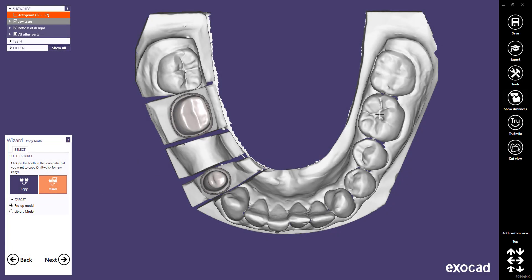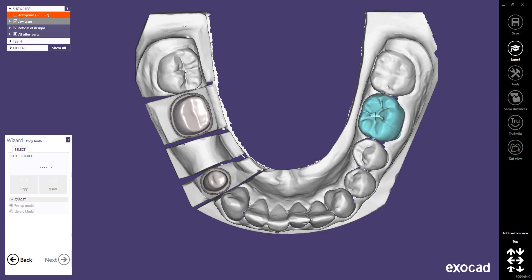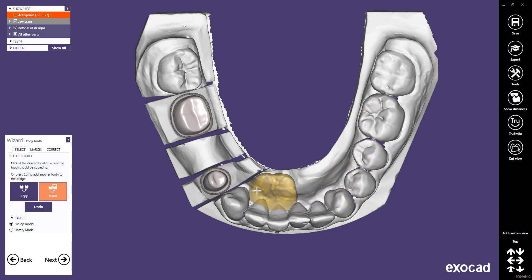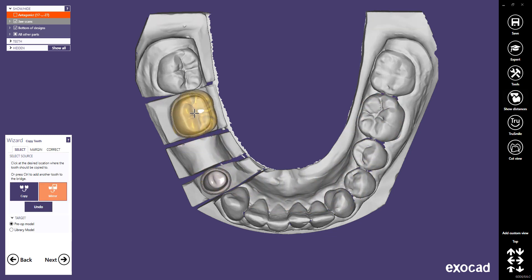Let's start with mirroring a tooth as virtual pre-op. To do this, simply click in the center of the tooth you want to mirror. Then move the tooth to the desired position, and set the mirrored tooth with a click.